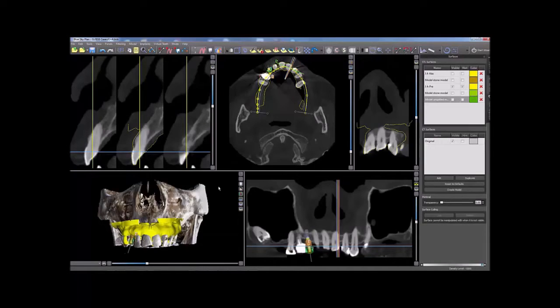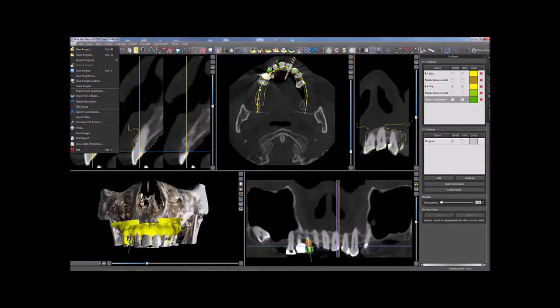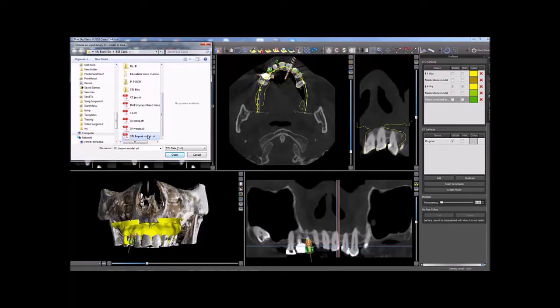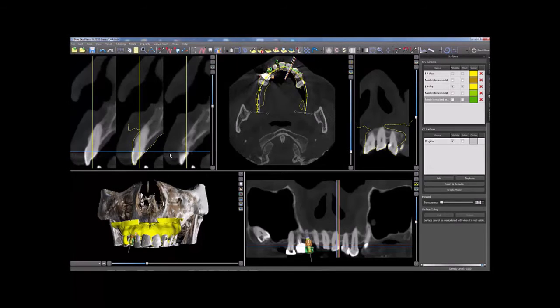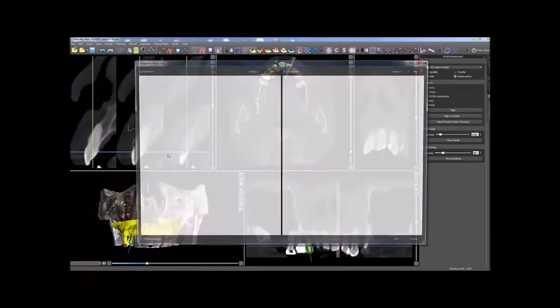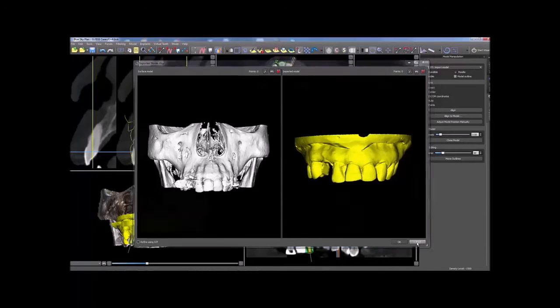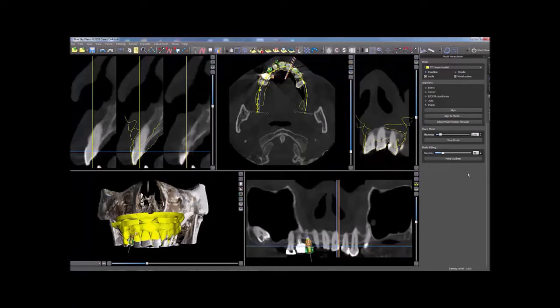Prior to importing an STL model, have the patient case open. Import the second model by clicking on File, then Import STL Model. Select the relevant STL file. When the Model Align window appears, click Cancel. Make sure the new model name is selected in the model panel drop-down.